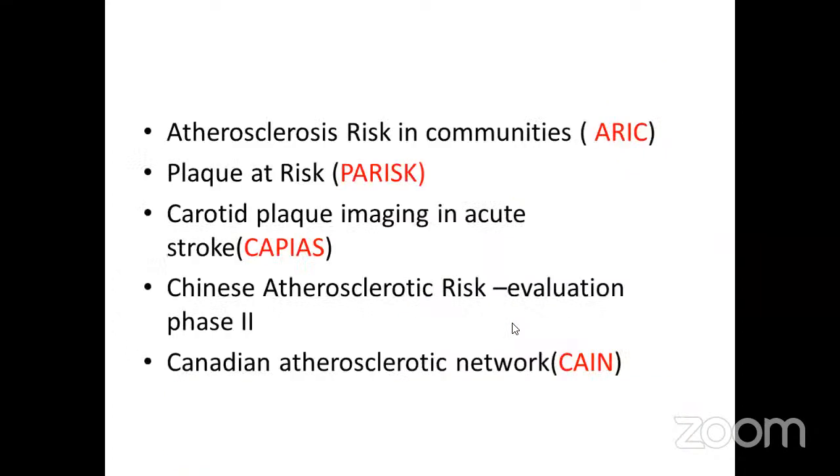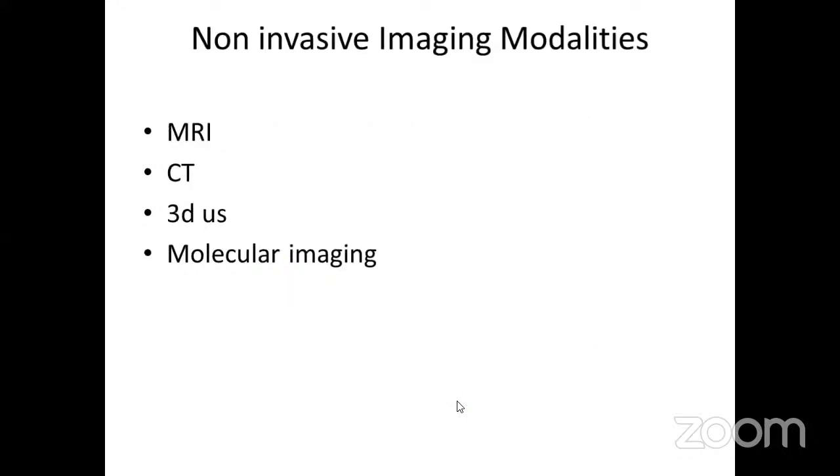And these are some of the studies that have incorporated vessel wall imaging, such as the Carotid Plaque Imaging in Acute Stroke study, Chinese Atherosclerosis Risk Evaluation phase 2, and the Canadian Atherosclerosis Imaging Network. Among the non-invasive modalities, we have routine MRI, CT, 3D ultrasound, and molecular imaging.